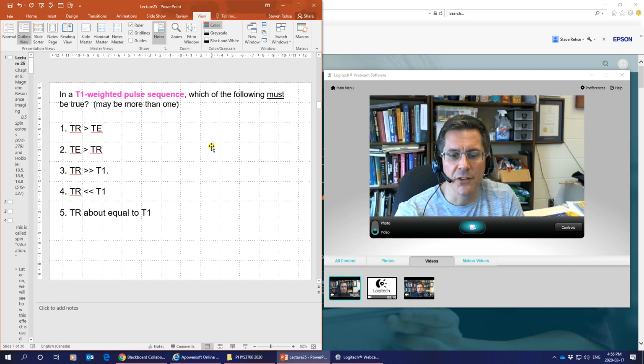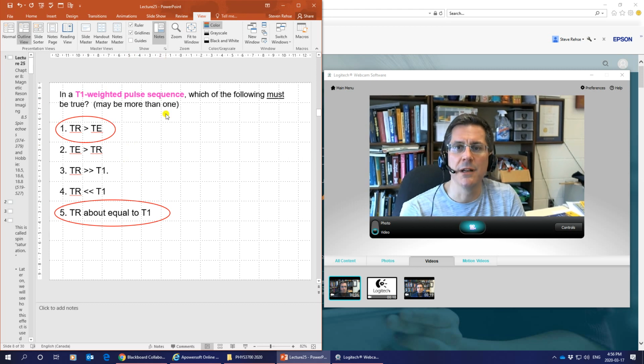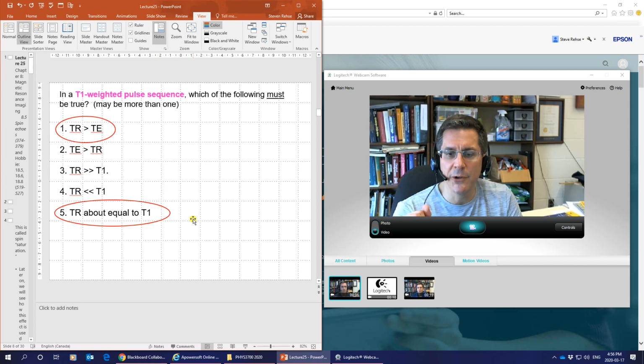Okay, welcome back. Hopefully you've had time to think about that. So what was the answer to this one? What did you come up with? Two things were true. In the T1 weighted pulse sequence, TR, which is not the recovery time, it's the repetition time, has got to be greater than the echo time. In fact, that's always true in all the pulse sequences. And to measure T1, this is called a T1 weighted pulse sequence because you're trying to make a measurement of T1, and you're going to see that to do that, this repetition time, TR, should be about equal to T1. It's got to be on the order of T1 to probe T1.